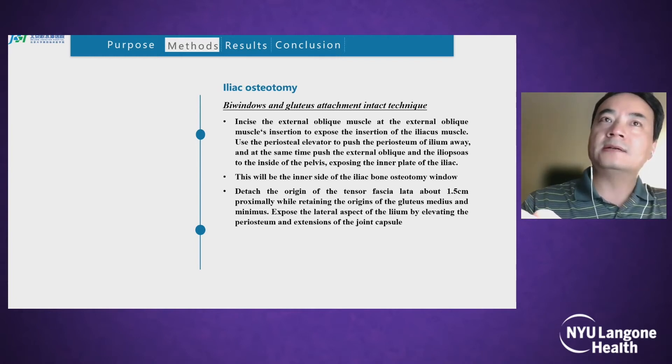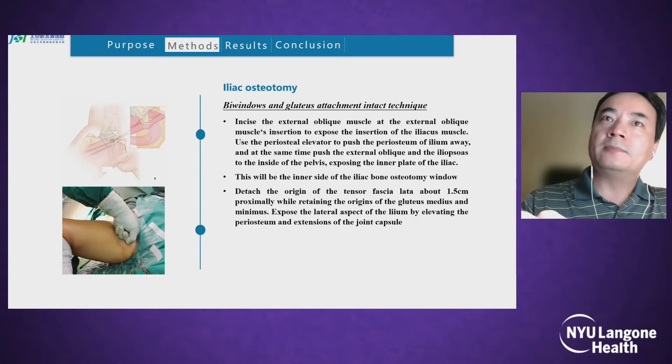Incise the external oblique muscles at their insertion to expose the insertion of the iliac muscles. Use a periosteum elevator to push the periosteum of the iliac away, and at the same time push the external oblique and iliac muscles to the inside of the pelvis, exposing the inner plate of the iliac. This will be the inner side of the iliac bone osteotomy window.